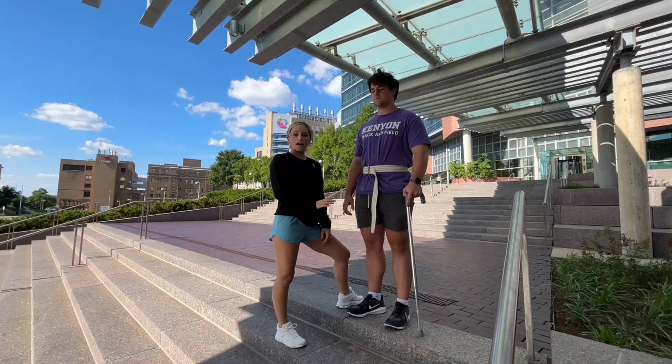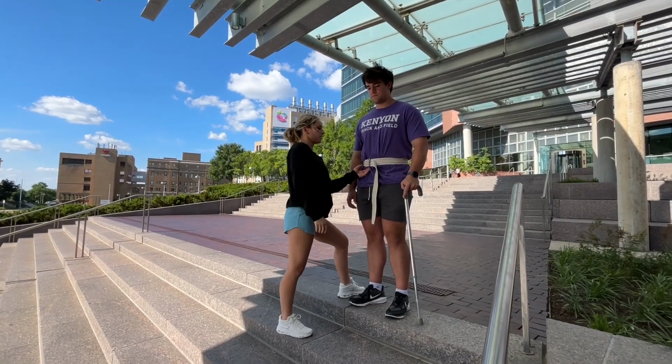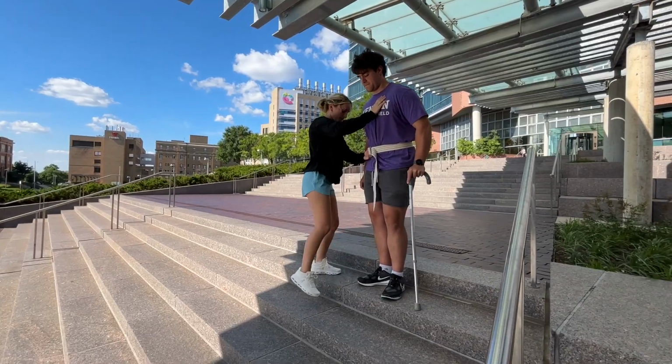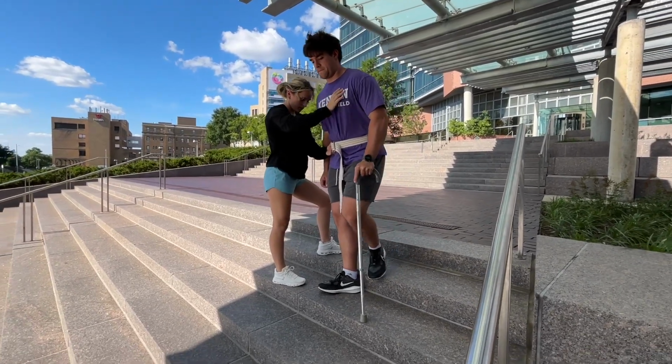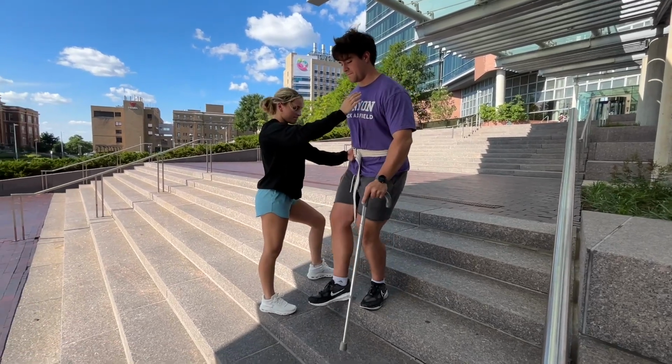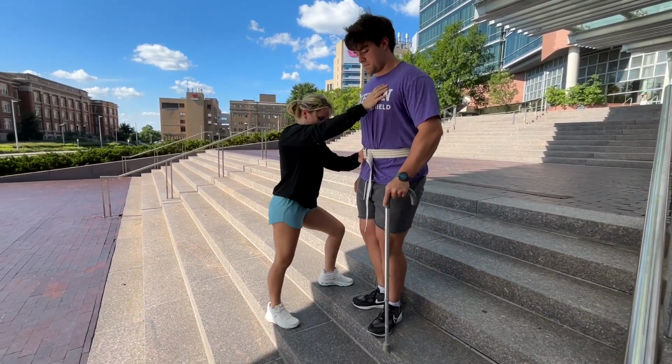Now we're going to be going down the stairs with a cane. To walk downstairs, the patient should lower the weaker limb while placing the cane on the descended stair, then lower their body with the strength of their uninjured limb. PTs should be in front of the patient with the same hand placements as for ascending stairs.